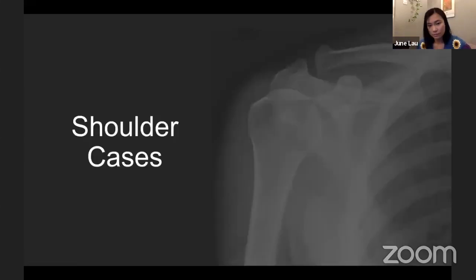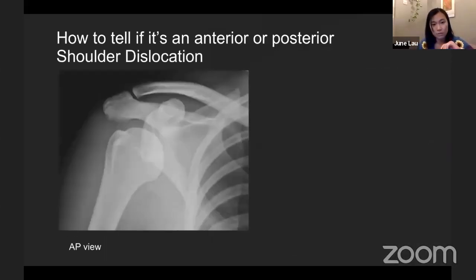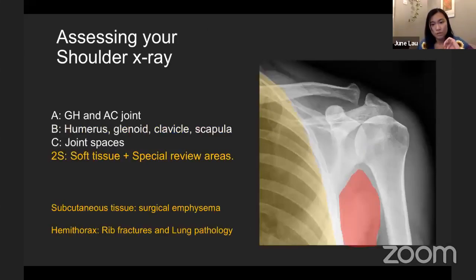And that's it. So that's A, B, C, 2S of the shoulder. I'm just going to leave this here for a bit, so if you wanted to just refresh your mind before we go into some cases.